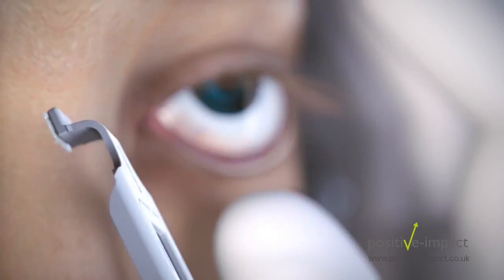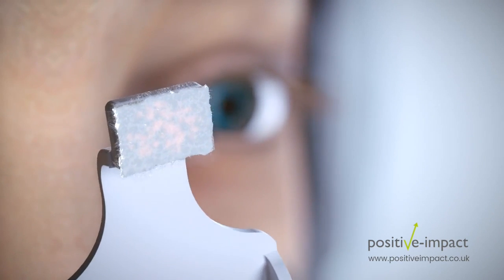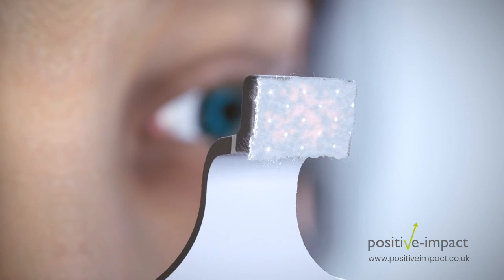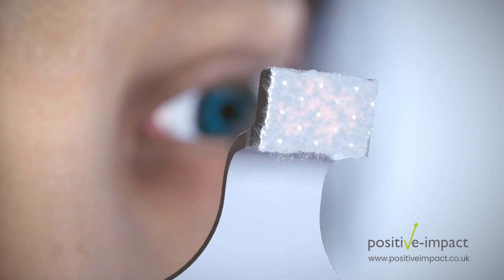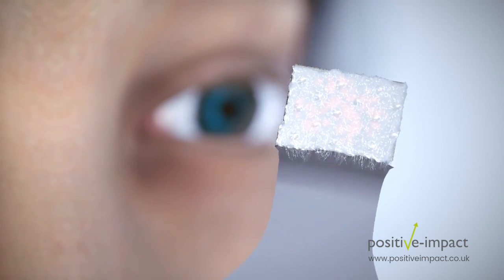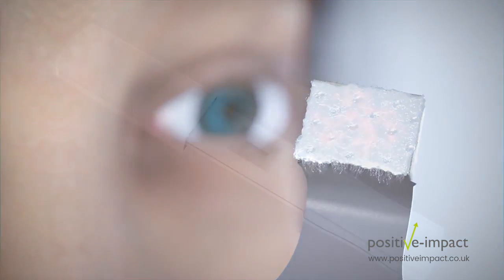Visually inspect the sampling fleece. When a sufficient tear sample is collected, the fleece will glisten. The fleece may also turn patchy pink in color, depending on the patient's tear composition. If the fleece is not glistening, repeat the tear sample collection process.